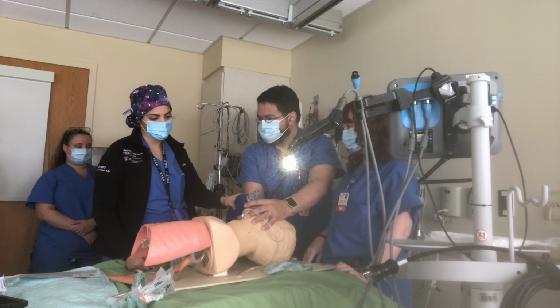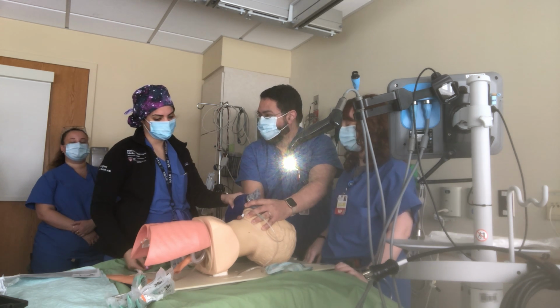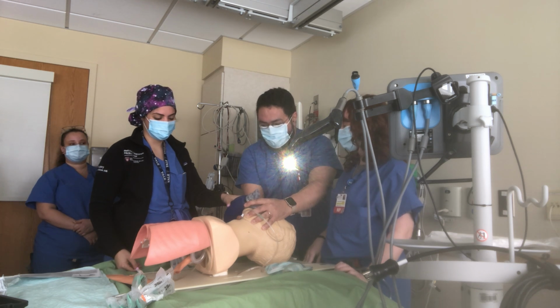Don't do like the orthopedic resident who ventilated once and left. Squeezed it once.